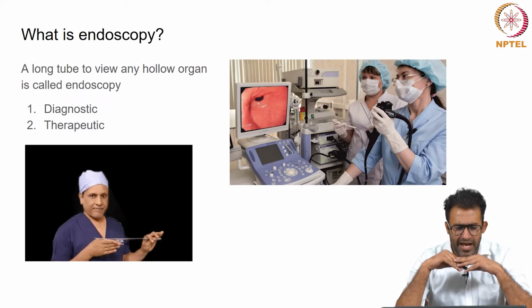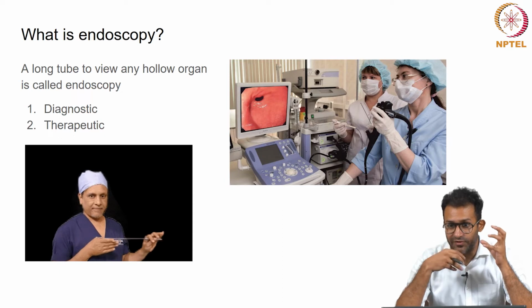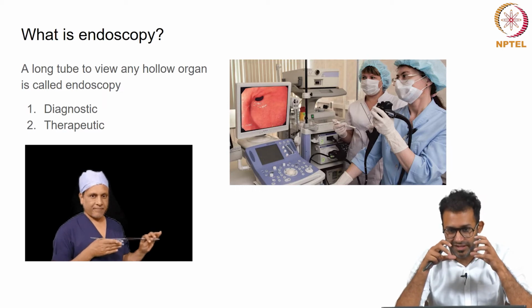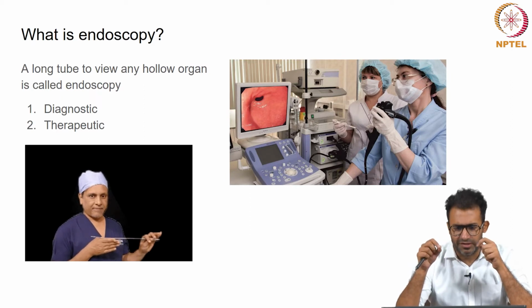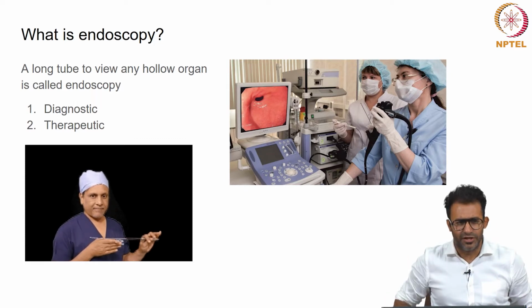And the definition of endoscopy is basically using long tubes to view any hollow organ. That hollow organ can be your esophagus, stomach, small intestine, large intestine. It can be your bronchus. Bronchus is the bifurcation of the windpipe. It can even be visualizing inside the abdomen, what we call the peritoneal cavity. So there are a lot of terms involved in this. A brief understanding of these terms would help you understand the entire industry and give you an overall outlook.